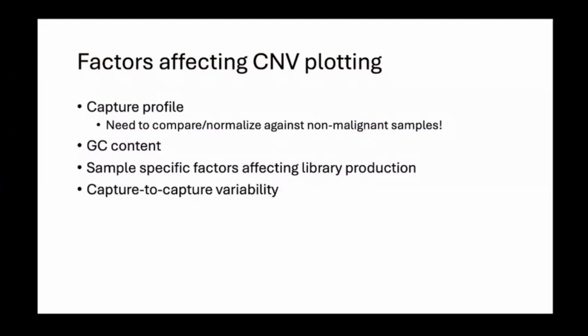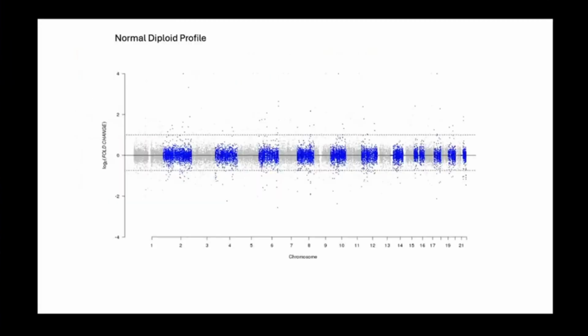So you may actually need to compare today's data against both a historical baseline and against a control sample that might be built into the same run. It depends. But eventually the goal is to get the data smoothed down into a really nice looking plot. And this happens to be a really nice one. They don't always look this nice.